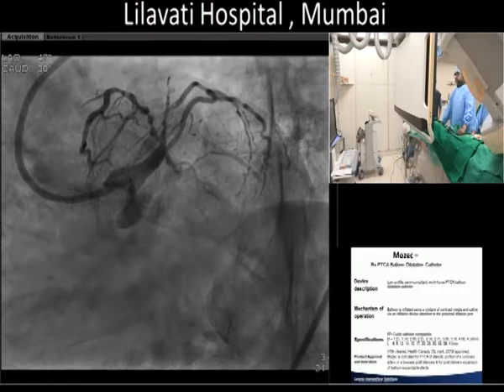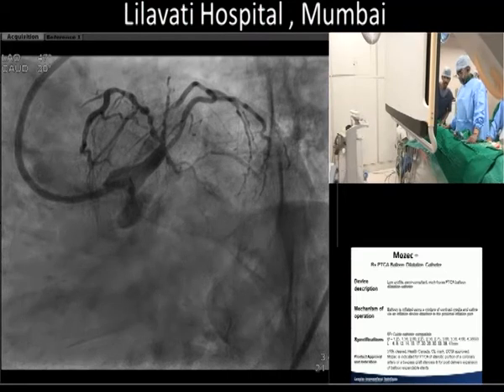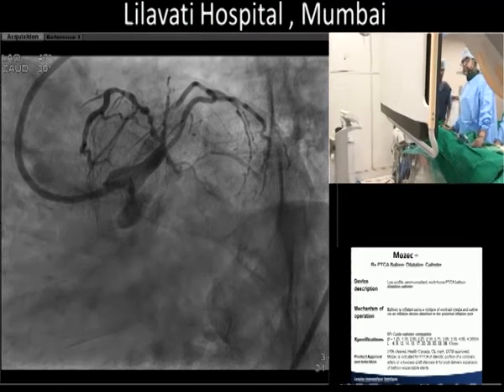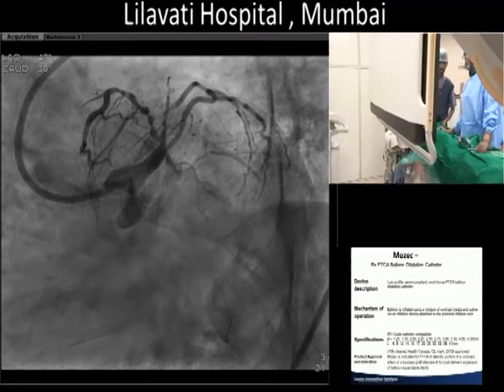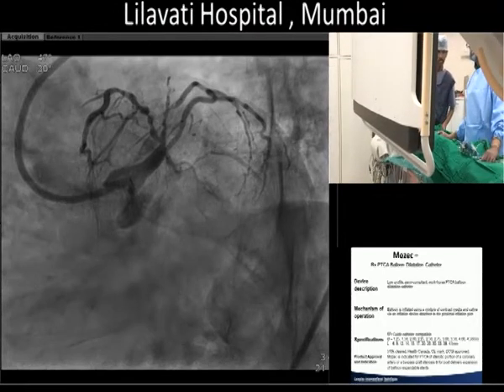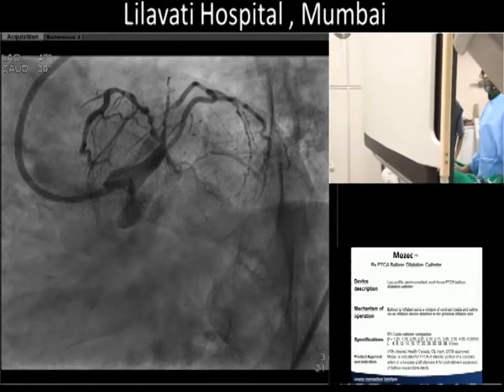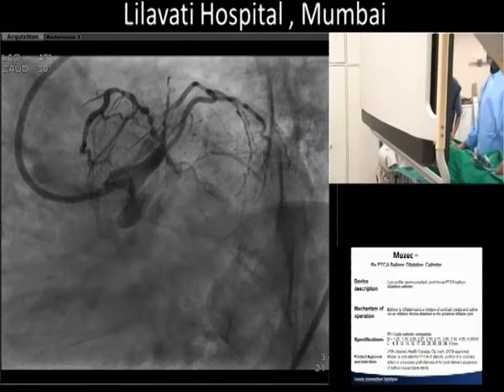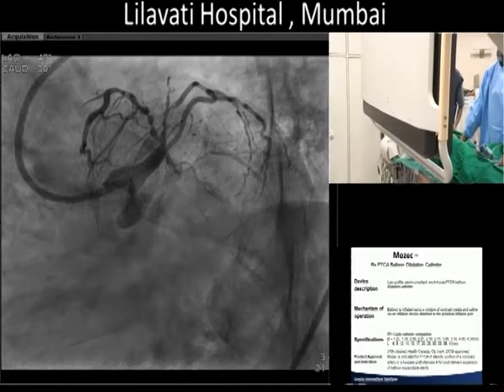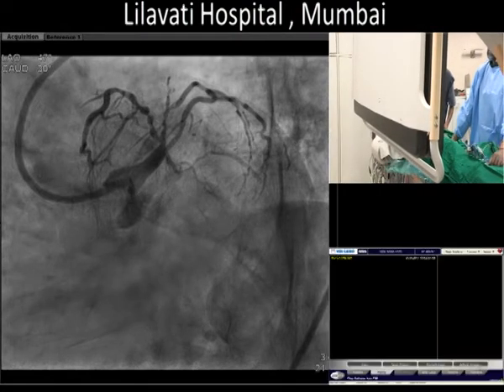So I would totally agree with you. This view, what you are seeing is the pre-dilatation lesion. The ostium of the diagonal appears to be free of disease. Yes. So I'll spare that diagonal ostium. Yeah, I would stent the straight diagonal first, the body, and then treat the LAD. That's correct. That's right. So that's what I intend to do.